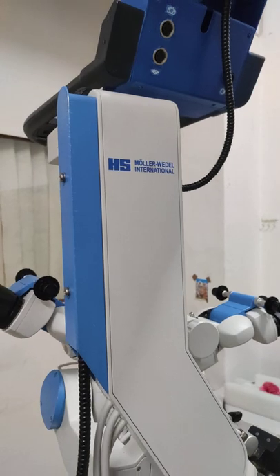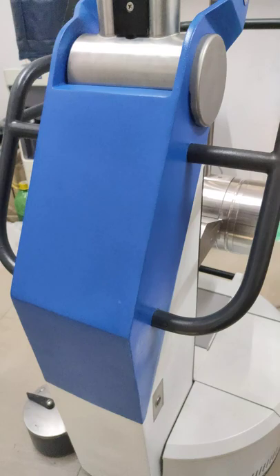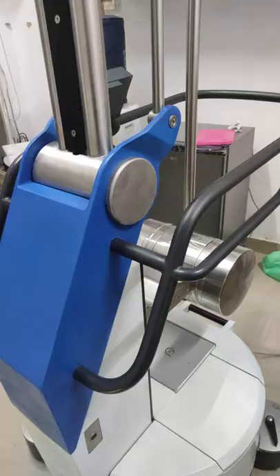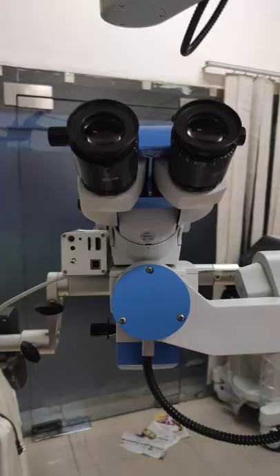This is the Möller-Wedel Hi-R 1000 refurbished microscope, but very rarely used — like new. You can see the condition: very excellent, with a very flexible stand and top-of-the-line optics, with 60-degree movement.